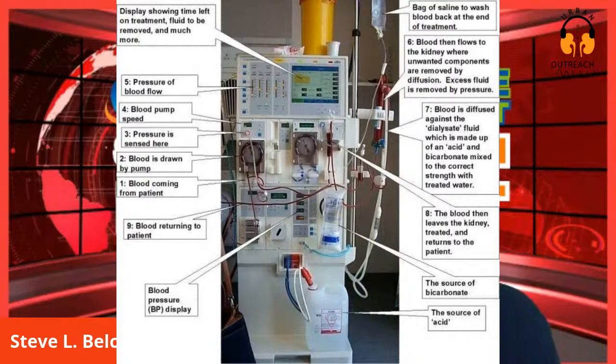Moving down from the top - this is pointing to the screen. Going to number one, that's the blood coming from the patient. Then number two is the blood pump - that's what pumps the blood. The pump keeps blood flowing from the body to the dialyzer and back. That's what the pump does.